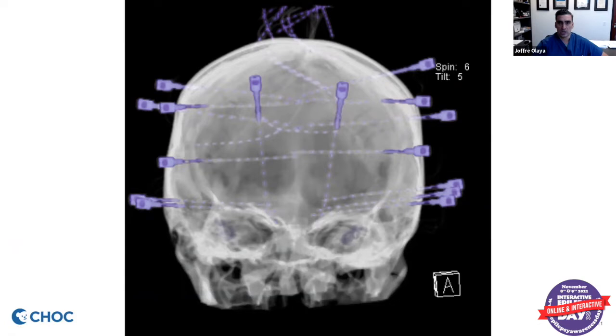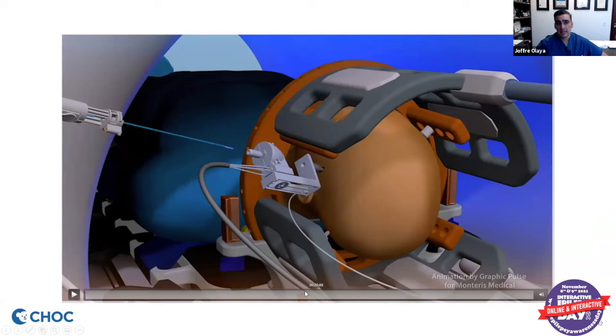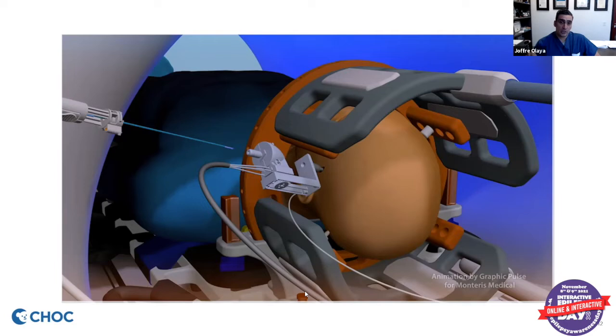Now once we get that information, if we find that the seizures are coming from a very focal, very localized area, then sometimes we can treat that again in a minimally invasive fashion by using laser ablation. The idea behind laser ablation is that we can burn the tissue that's causing the seizures, ablate it, and you get it to a certain temperature that eventually causes cellular death. And so then that tissue is non-functional. Where, as before, there was abnormal electrical activity coming from there and spreading and causing seizures, if you burn that tissue, then that area is not able to cause seizures anymore.